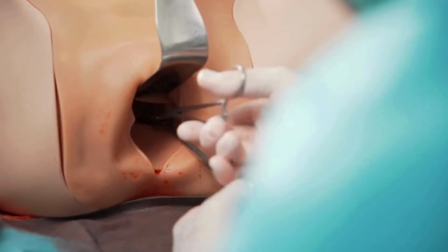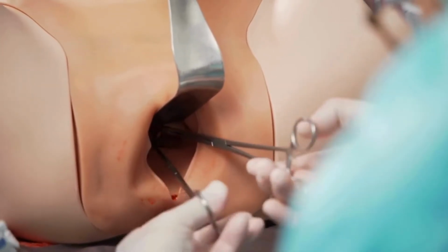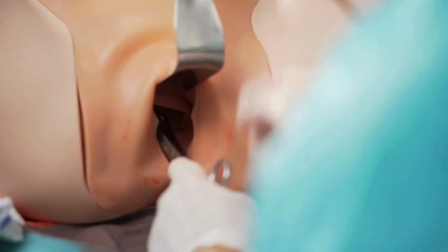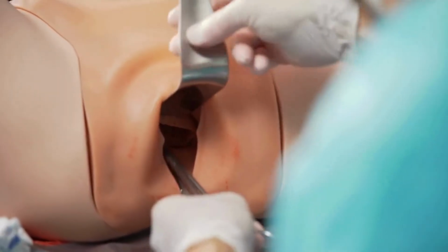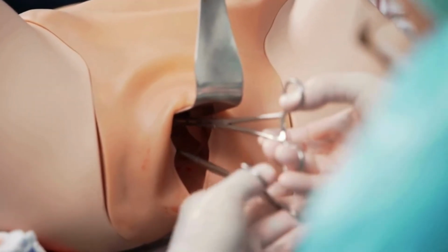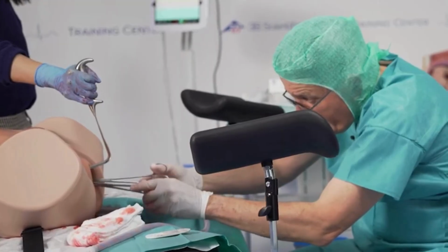You can go around the cervix step by step and check integrity. And there's no model I know of that is suitable for training that situation. That is one of the most important issues in PPH training. And now we have a 360 view of the cervix. Everything is intact.